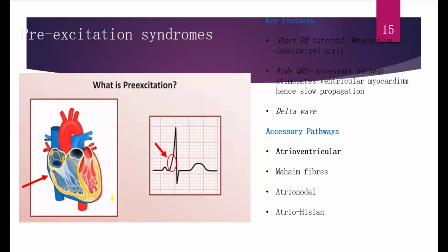And then finally, something I just wanted to add in passing is the pre-excitation syndromes. What we have here is a pathway, and then the aberrant pathway on this side. It moves through the AV node, and it moves through the aberrant pathway. This part is generated by the aberrant pathway, and then the rest of the QRS is taken over by the normal pathway because it's faster. The aberrant pathway causes what is known as the delta wave in Wolff-Parkinson-White syndrome, and then the normal pathway takes over.